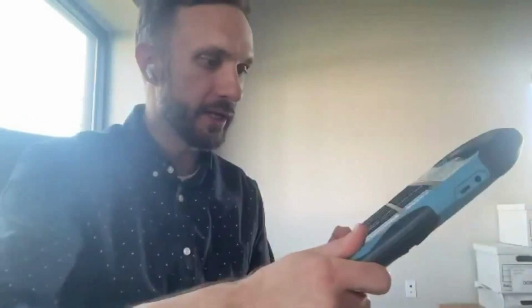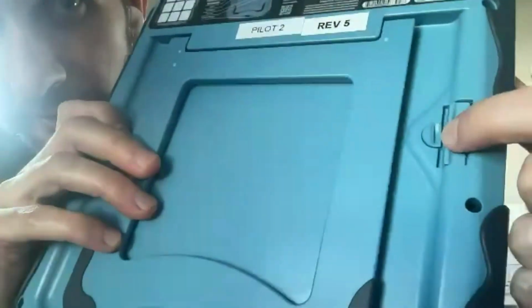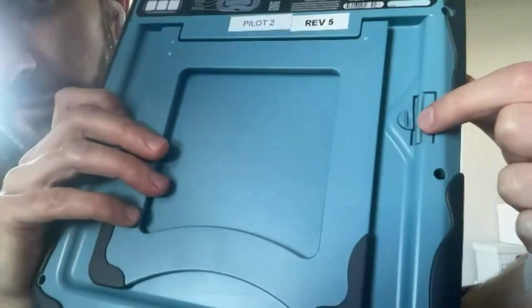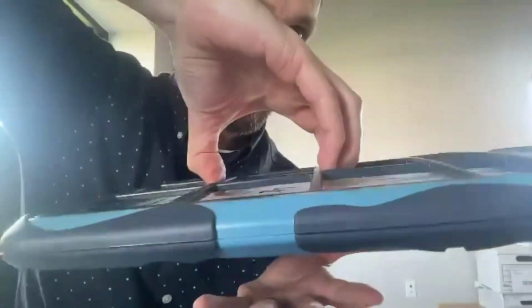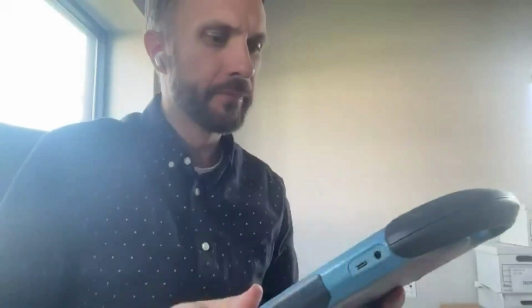So, and the grids, as I said, are interchangeable. There is a lock button here in the back that allows, if you turn this little circle guy here, it will lock it into place. This is also the button that I will hit to release the grid. And honestly, even with the lock unlocked, it is still in there. I'm holding it just by the grid. So it really is in there nice and solid, and even more so with that lock turned.